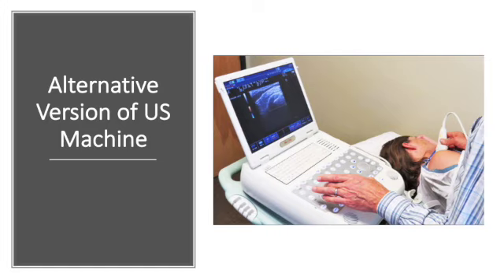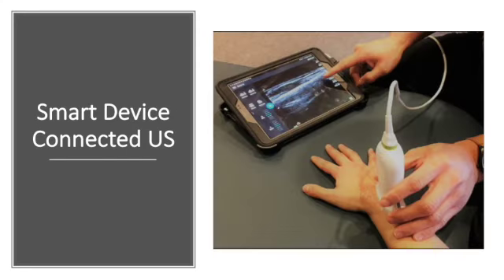So this one's going to run somewhere between 8 and 10 grand. But as we're going to see, the technology has gotten so good that we're actually able to purchase ultrasound machines for a lot less money and have actually more accessibility and portability. This is a version of the current one on the market. So the one that we have purchased is called Butterfly IQ. And as you can see, it is an ultrasound unit that plugs directly into an iPad or an iPhone.